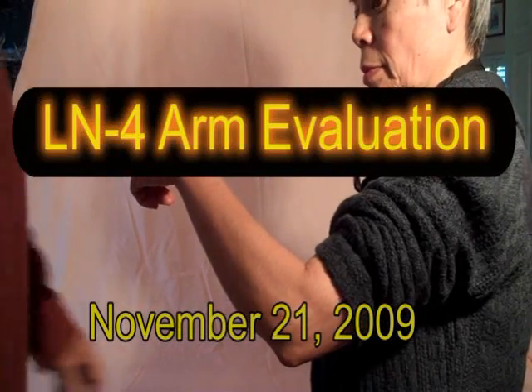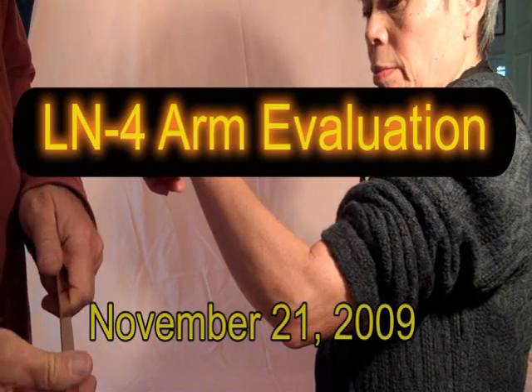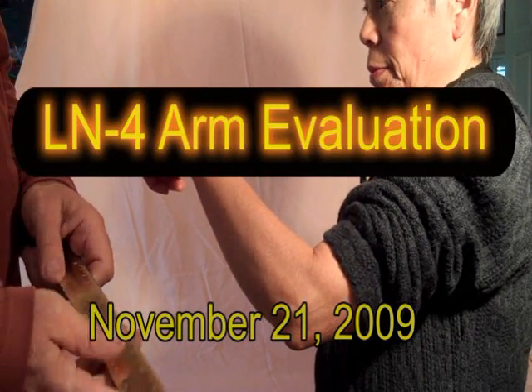We're going to demonstrate an evaluation of an arm for a LN4 prosthetic hand.